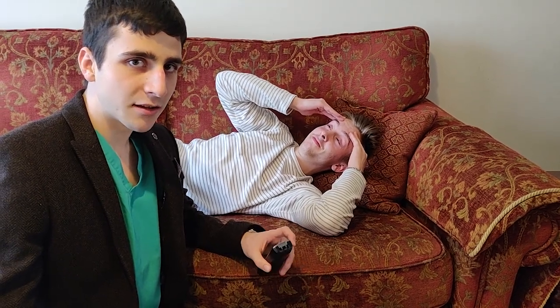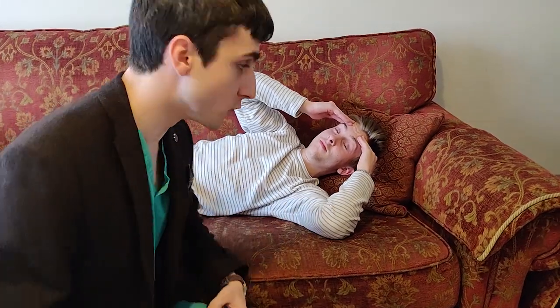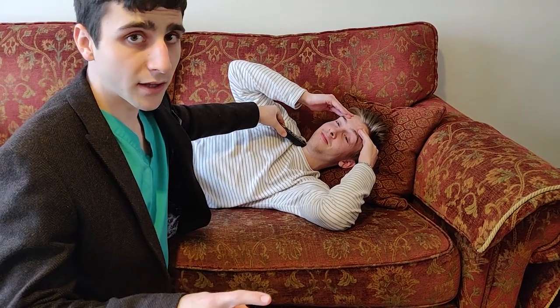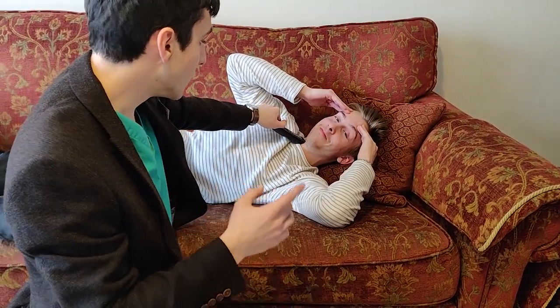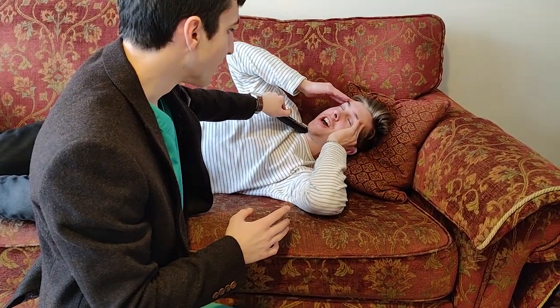That's alright. I have some bad news. Rick's aneurysm has gotten worse. So we need to give him an urgent ultrasound. So we place the transducer on his neck after putting on some contact gel. Notice the angle here. It's about 30 degrees. And we can use the Doppler scanning to analyse the blood flow in his neck and identify the clot. And hopefully save Rick. Why do we have it at an angle of 30 degrees though?